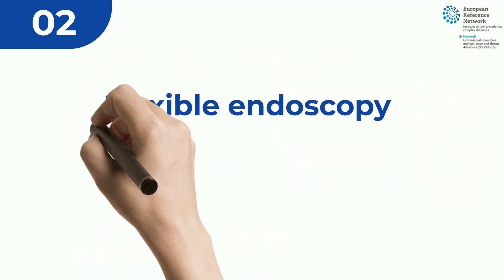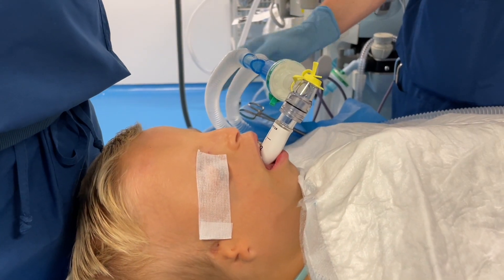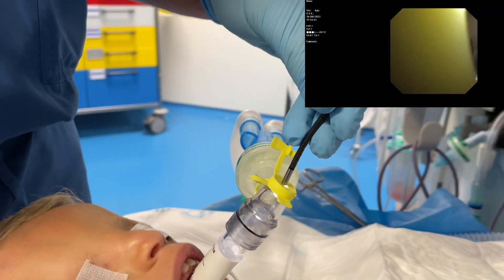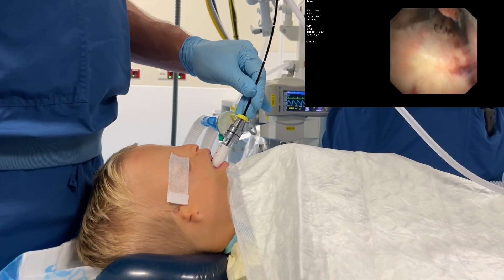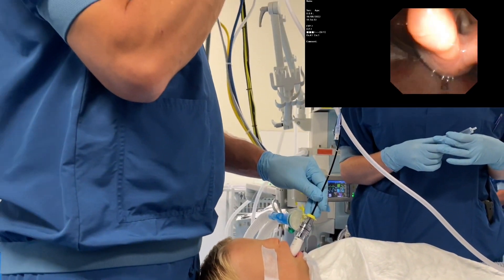The patient is ventilated over the laryngeal mask. A special connector is used to run the flexible endoscope through the laryngeal mask. A good view of the larynx is obtained. If needed, the larynx can be anesthetized using application of topical lidocaine.